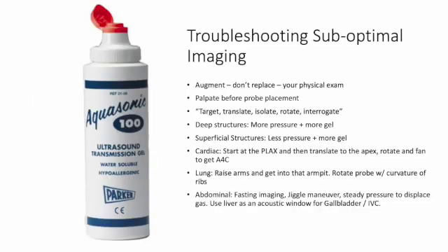So what if you're troubleshooting and you're not getting the greatest image? Well, first of all, don't panic, breathe. It's going to be okay. And then remember, have you augmented your exam? Have you already touched the patient? Palpate before you place the probe down, and then go back to that rhyme: target, translate, isolate, rotate, interrogate.